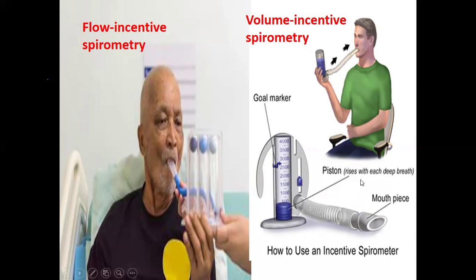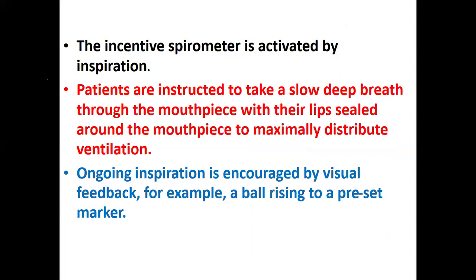As the patient is breathing, they are able to see the marks on the volume. So if they breathe in today and reach 1,500, the next time they should work harder to take it to 2,000 or 2,500, and just going up like that gives them an incentive to work harder and harder, so that they are even able to see their improvement.